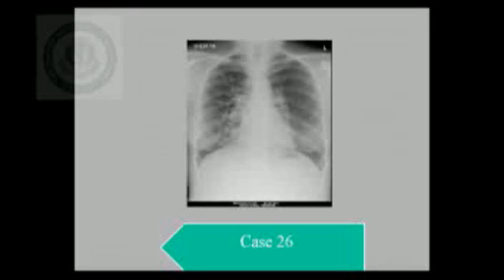Now, cystic bronchiectatic changes in the right midzone. Multiple cavities are noted in the right midzone with air fluid levels, and this is a case of cystic bronchiectasis in the right middle lobe with signs of acute inflammation. That is, the fluid level represents the acute inflammation.